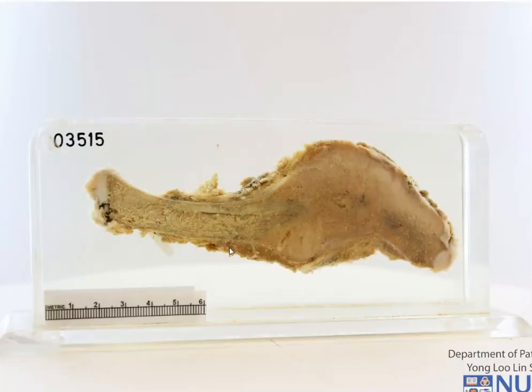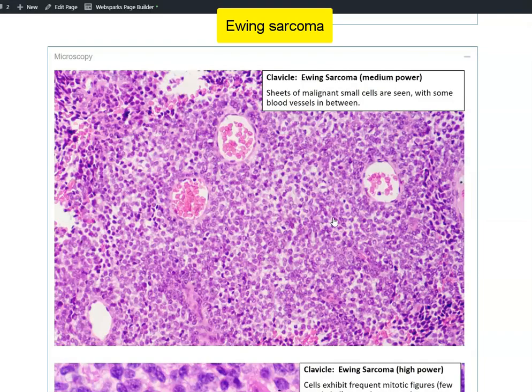This is a case of Ewing sarcoma. Ewing sarcoma belongs to a group of tumors morphologically known as small round blue cell tumors.